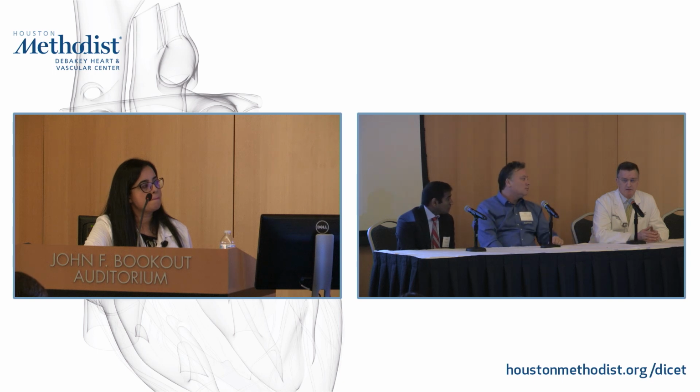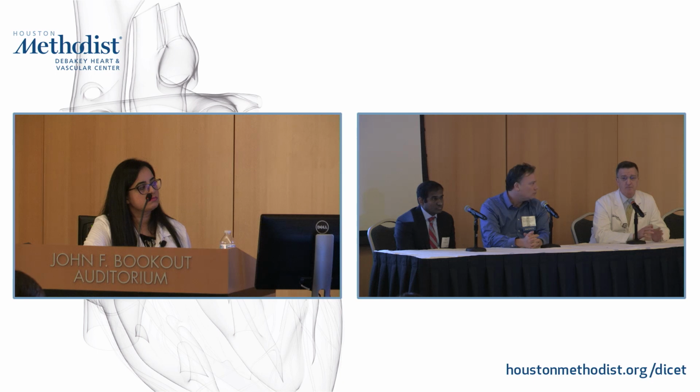I think you want to differentiate between rescue and recovery. Yeah. And I think that ECMO is a very good, quick, effective way to rescue someone. But at least in my opinion, I don't think it's a good way to, as in my comments earlier, a way to recover someone unless there's something that's going to get better by itself.